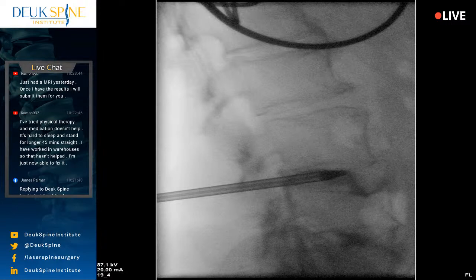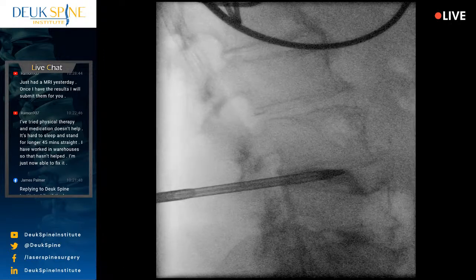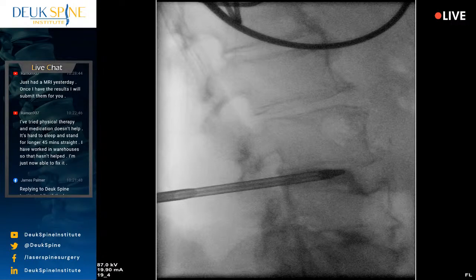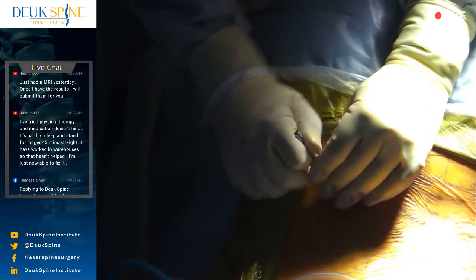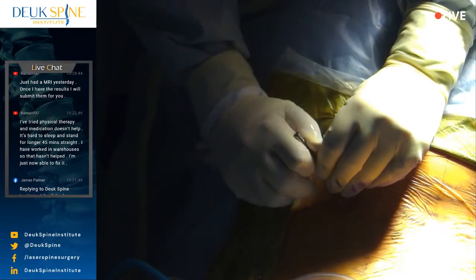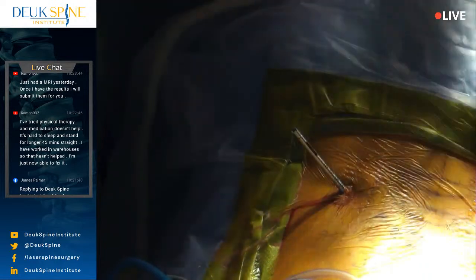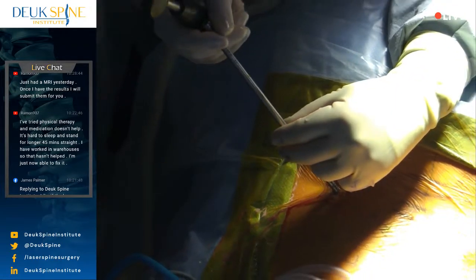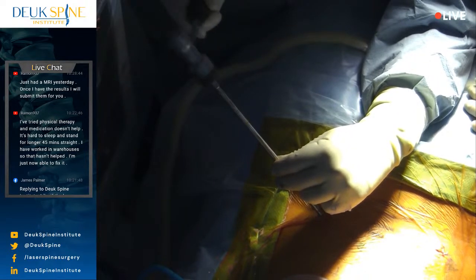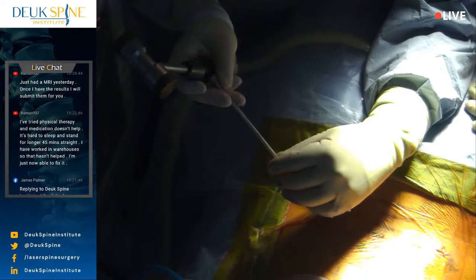So if you do this kind of surgery and you go through the muscle, the bleeding usually comes from the epidural veins, which are the little veins around the nerves in the spine. Or it comes from a vein in the muscle. So either way, you put a little bit of pressure. As long as it's venous bleeding, it's low pressure bleeding. It's 10 millimeters of mercury. It won't create an epidural hematoma or an intramuscular hematoma. The only kind of bleeding that would do that would be arterial bleeding. And, you know, we're not anywhere near arteries.